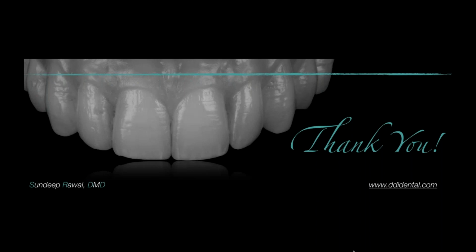When a patient is totally edentulous and they're wearing maxillary and mandibular complete dentures and you're setting them up for implant placement, most protocols today require you to do what we call a dual scan technique. You put some sort of fiducial marker on the denture, meaning gutta percha or similar markers. You scan the patient wearing the dentures in the mouth, and then you scan the dentures by themselves. It's called a dual scan technique.